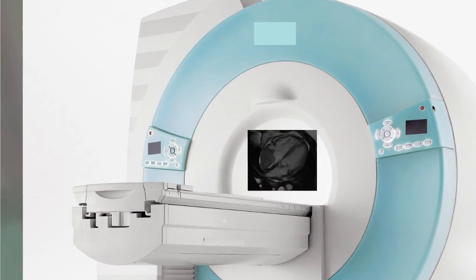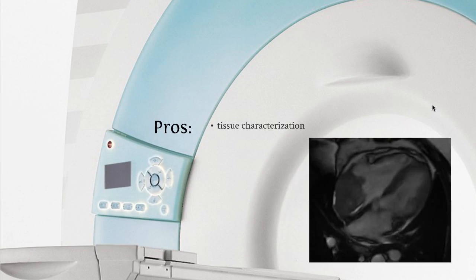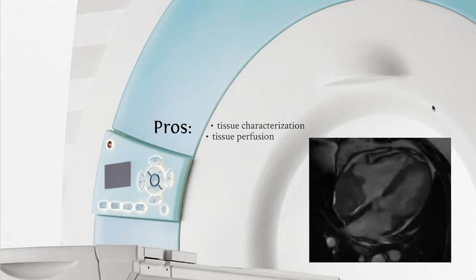Cardiac MRI. So cardiac MRI has the best tissue characterization of all the modalities. Soft tissue assessment, even without contrast, has a very high level of tissue characterization. We can also look at tissue perfusion. We can do first pass and second pass enhancement, and also look for delayed enhancement.